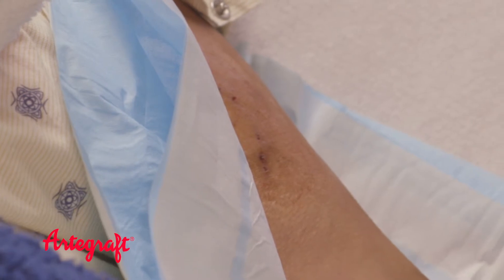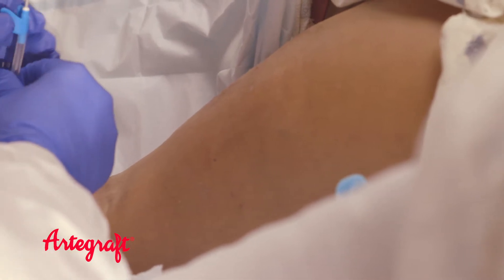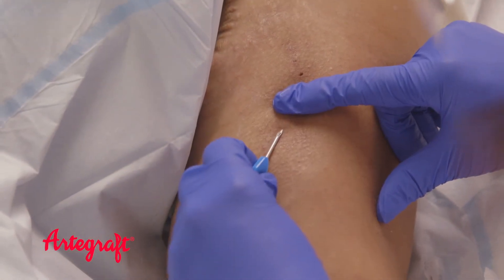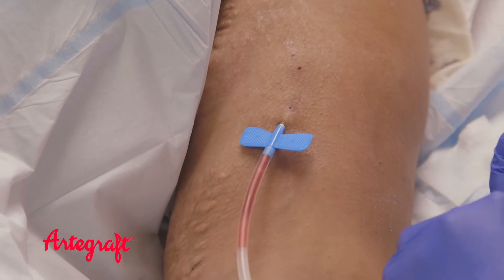It should be easy to feel the pulse or thrill and hear the blood flow or bruit with a stethoscope. ArtoGraft is accessed in the same manner as a native fistula. Needles are inserted at a 25 to 30 degree angle, similar to drawing blood or accessing a native fistula. They should not push too hard or deep — be careful not to infiltrate the graft.